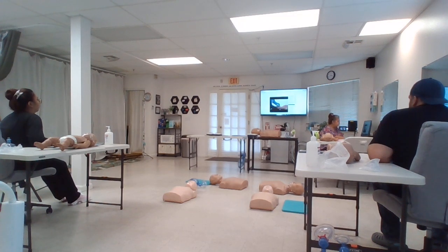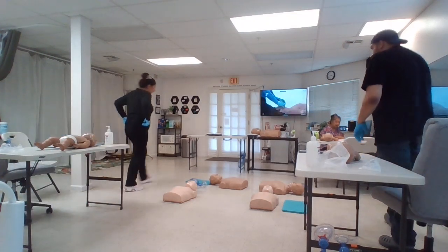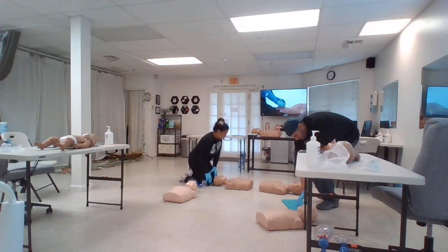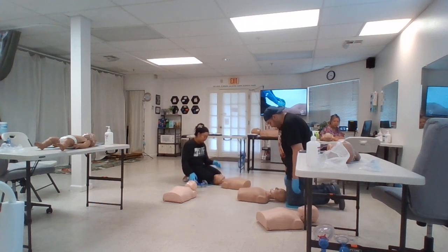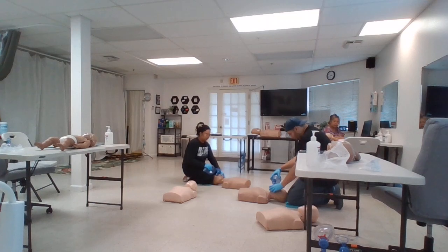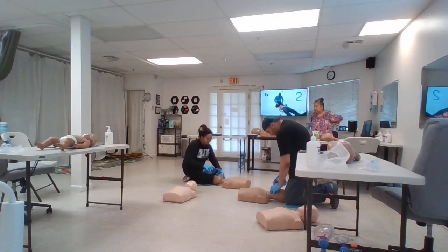Okay, so now we're going to practice while watching on rescue breathing. So get on the floor, position the mannequin head towards your body. For 6 seconds. Hold. Get ready. Begin in 3, 2, 1.